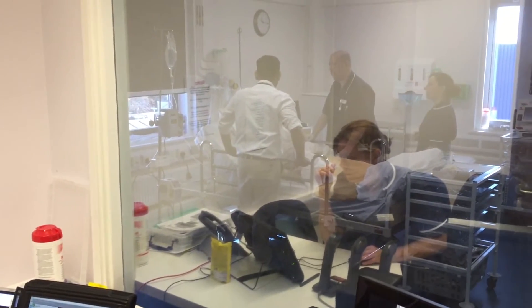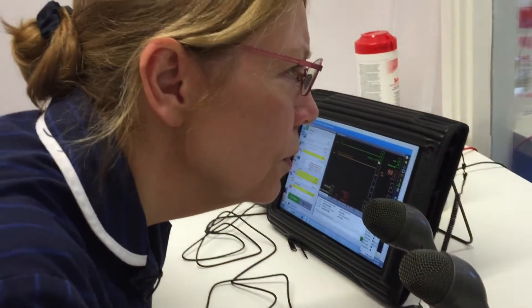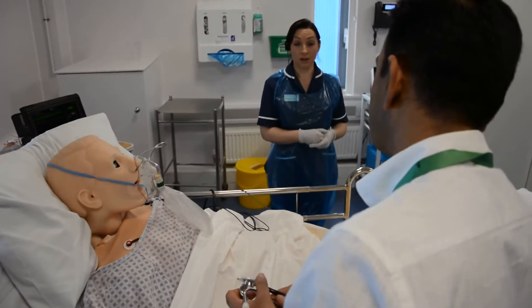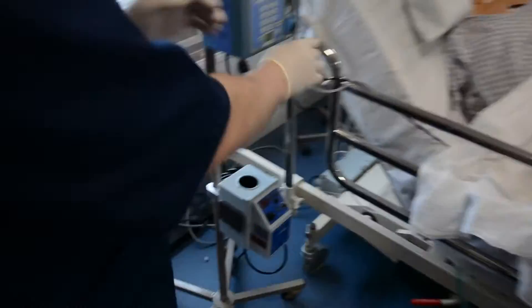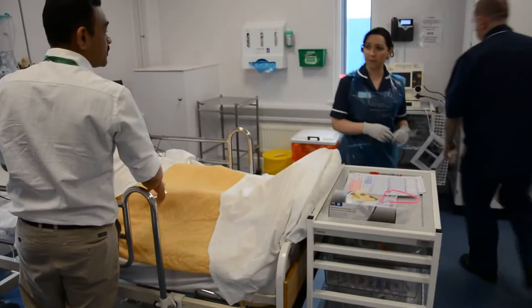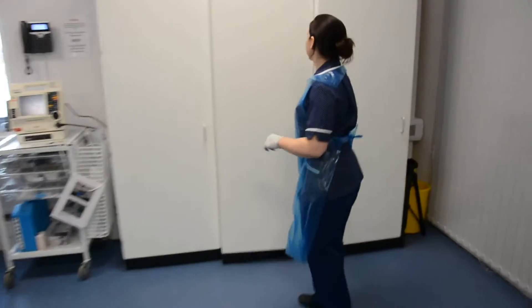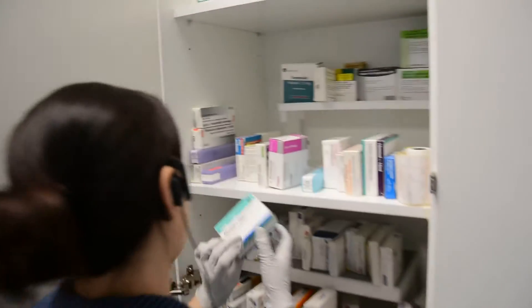I'm also able to talk on behalf of the patient, so if they ask how the patient is feeling I'm able to say 'I've got pain,' 'I'm not feeling very well,' 'I'm having difficulty breathing' — whatever the situation — and being able to talk back in real time just as a patient would makes it really realistic for the delegates in the scenario.